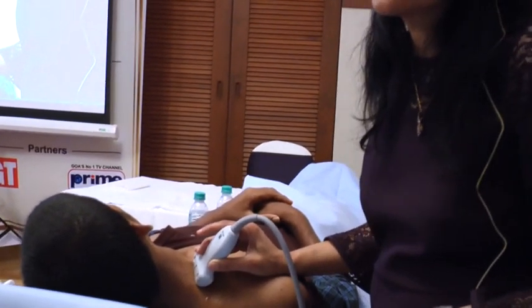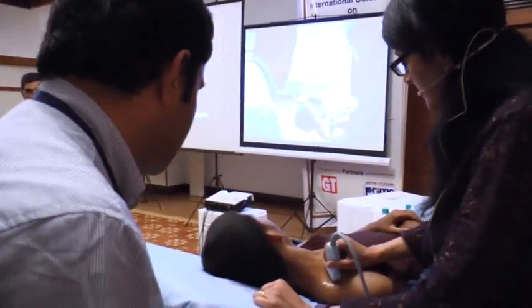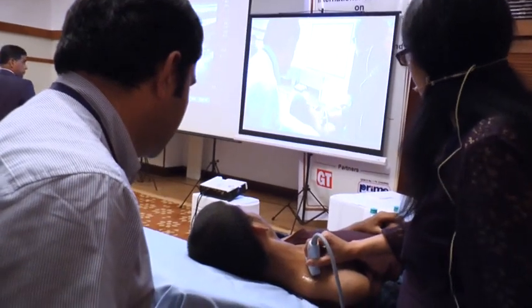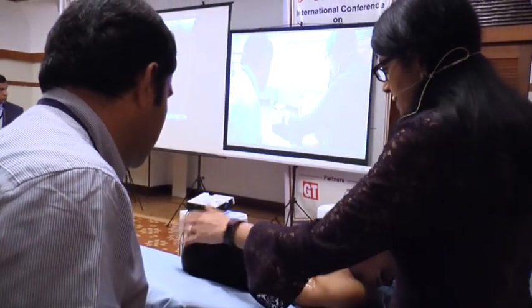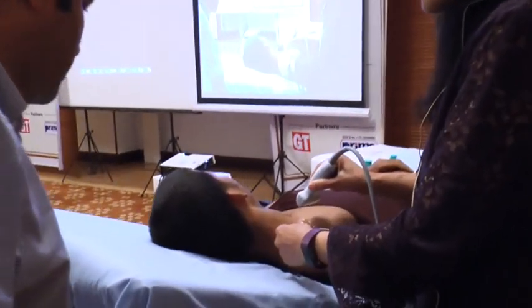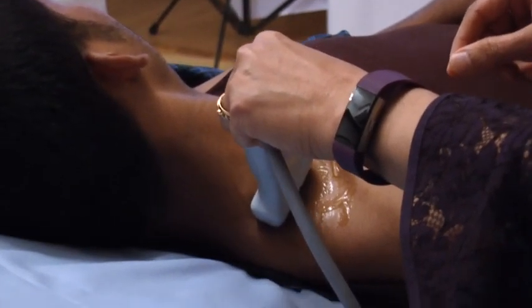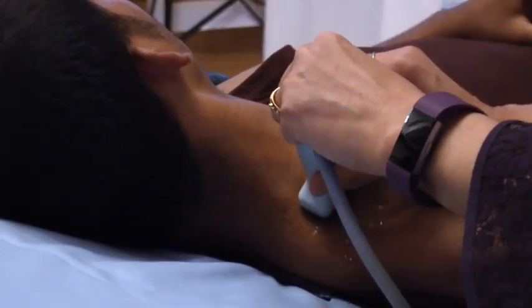Any questions so far with the scanning? So the probe placement, the normal classical one, is this. And the Darby approach is where, if you have your patient on the lateral side, you place a pen just there at the root of the neck, and that's where the probe is placed. So this is how it will be.